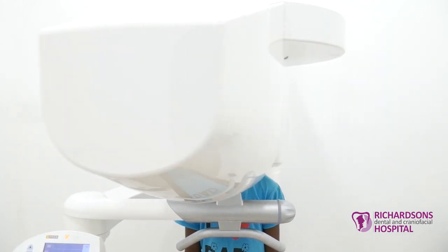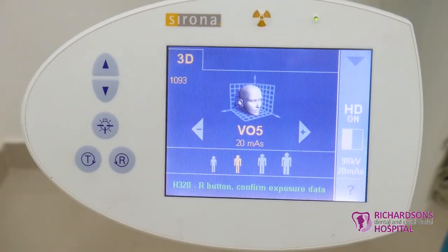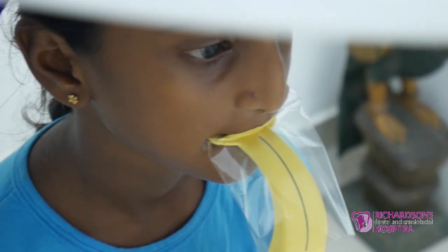We have this in our facility, so we are able to use it for kids who are even five to six years old and even elderly people. The entire face comes within the scan area — this is the size of the film. Since our face is small, the cone beam goes around and captures the scan.